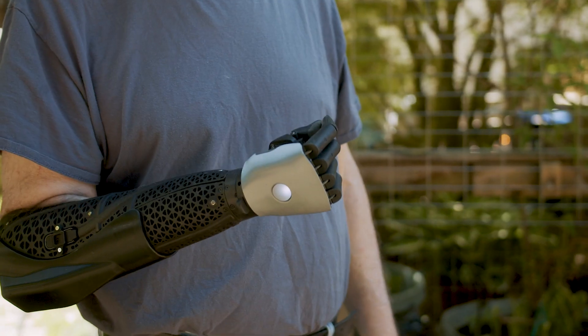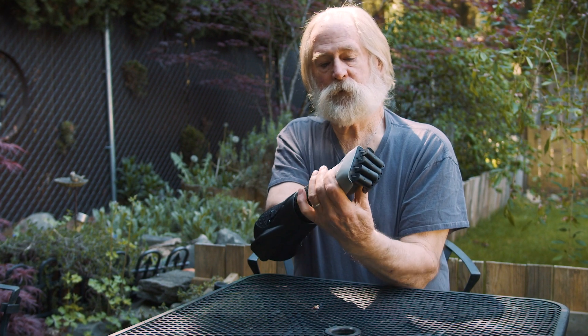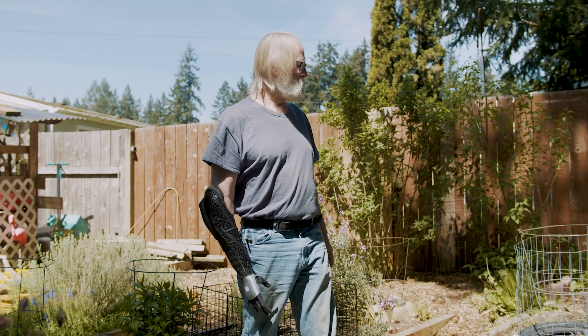I think the design is great. It turns, it'll rotate around with the push of a button. This one's really light, which is nice for the comfort of wearing it all day.